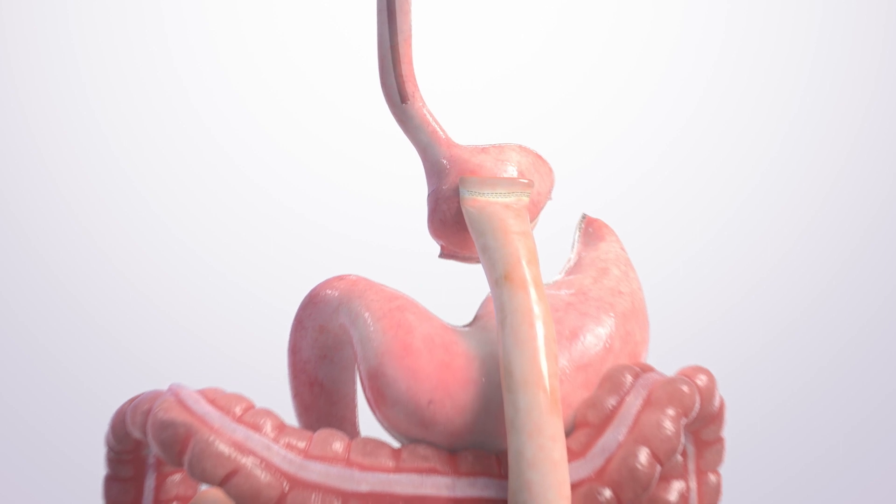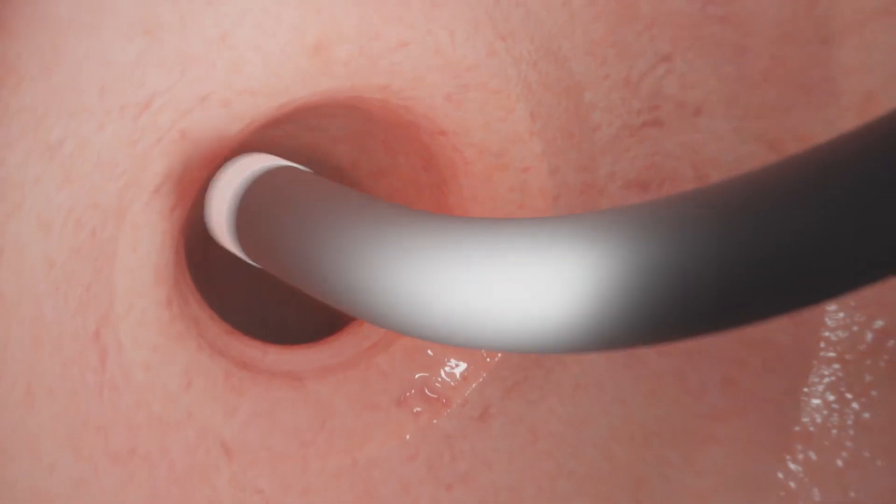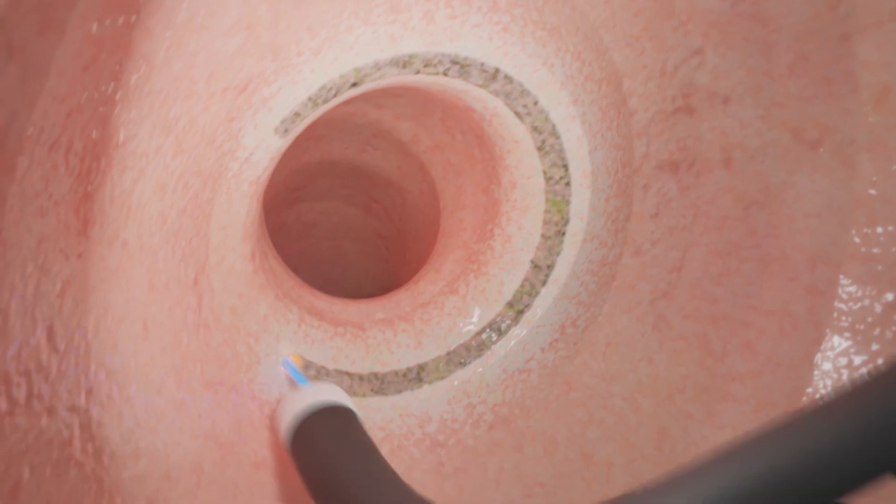While you are asleep, the doctor passes a camera through your mouth and into your stomach. After inspecting the area, the doctor prepares the tissue around the outlet to be re-tightened.